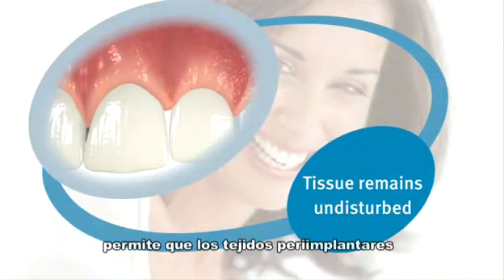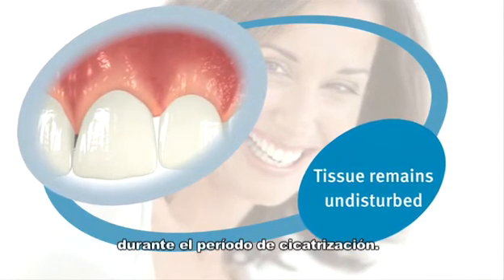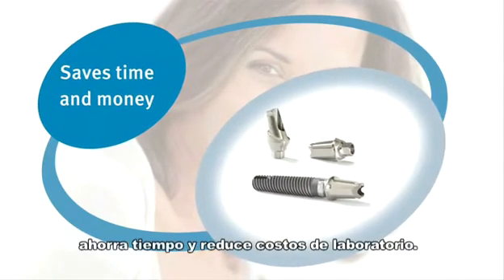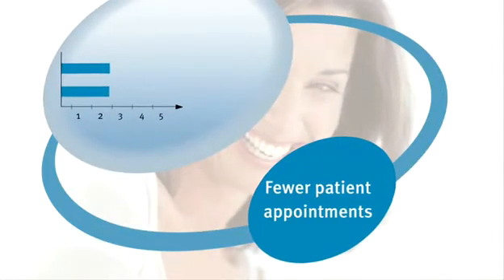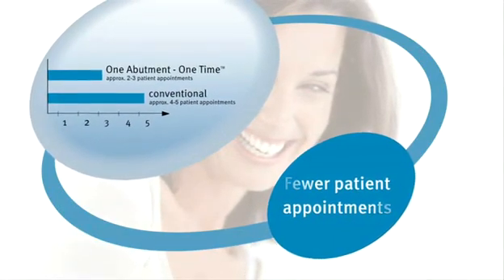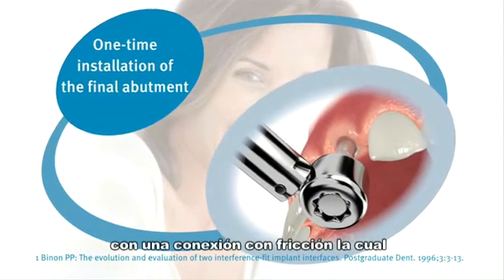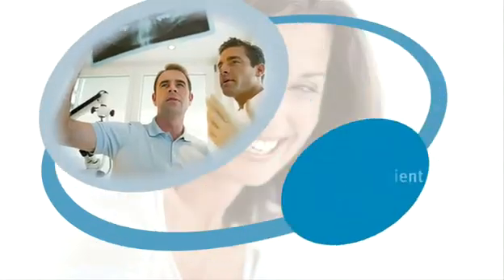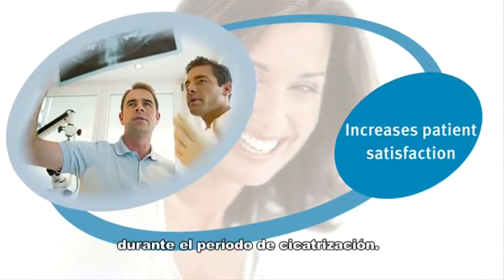One abutment, one time protocol allows peri-implant tissues to remain intact and undisturbed during the healing period. The streamlined protocol saves chair time and reduces laboratory costs. Fewer restorative visits than conventional protocols. One-time installation of the final abutment with a friction-fit internal hex connection that virtually eliminates micro-movement. This increases patient satisfaction by providing a provisional crown during the healing period.